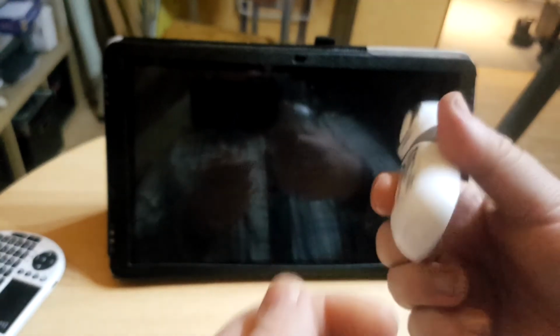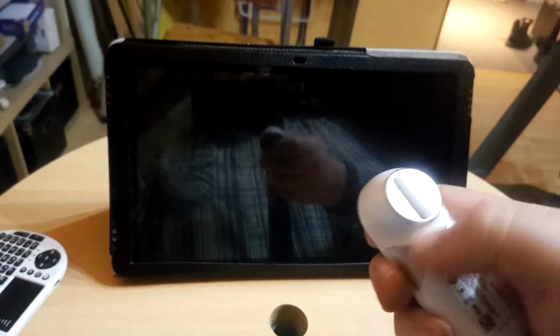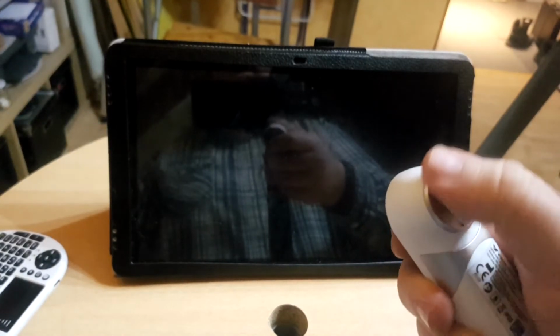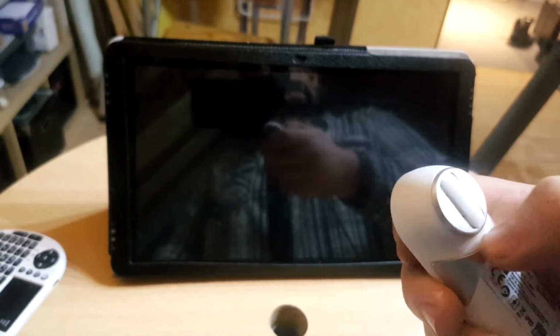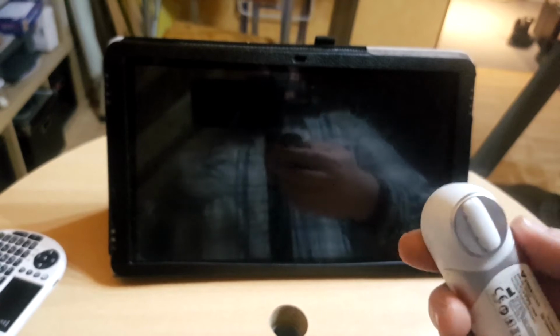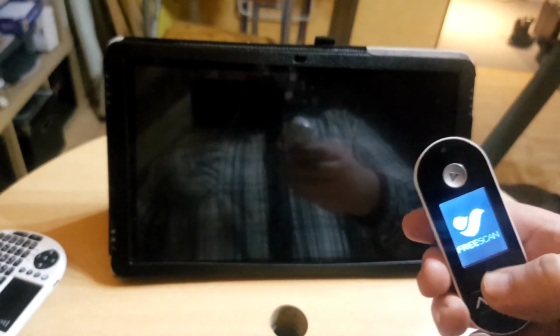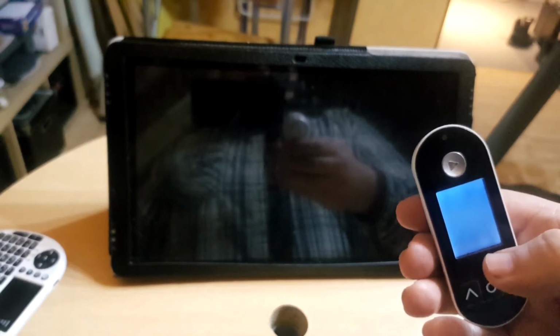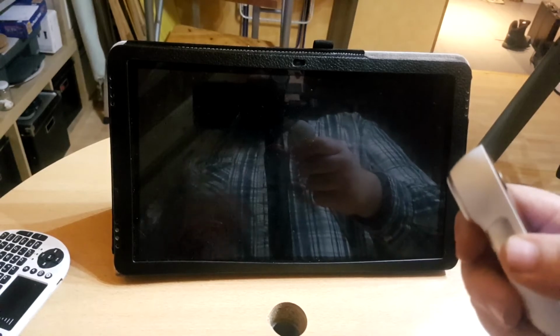You see here, it does not have any cuff or anything. All it has is these metal pad kind of things, electrodes, so to speak, and this tiny cushiony thing that actually reads your pulse wave, and by analyzing both ECG and pulse wave, it calculates your blood pressure. And how easy this is, I will show you right now.